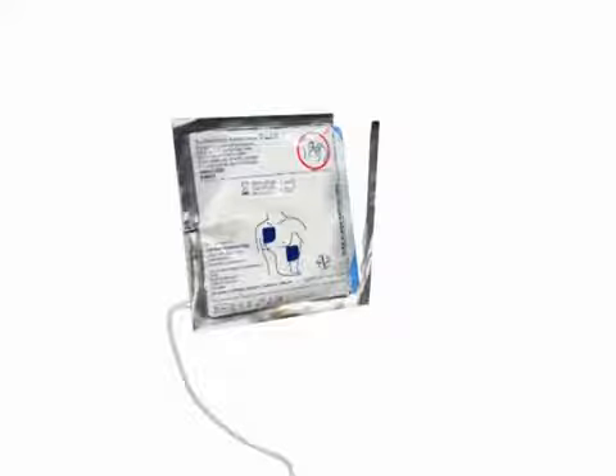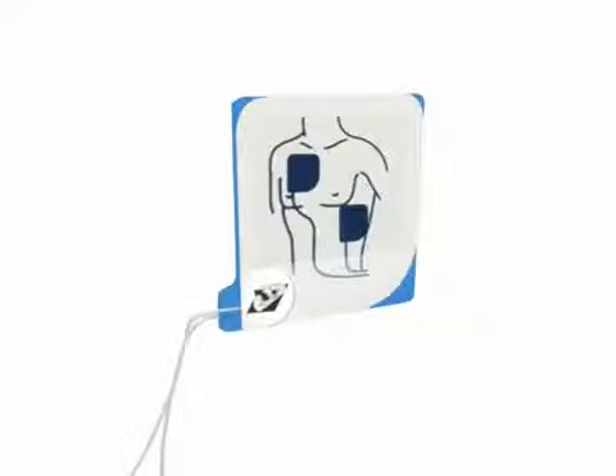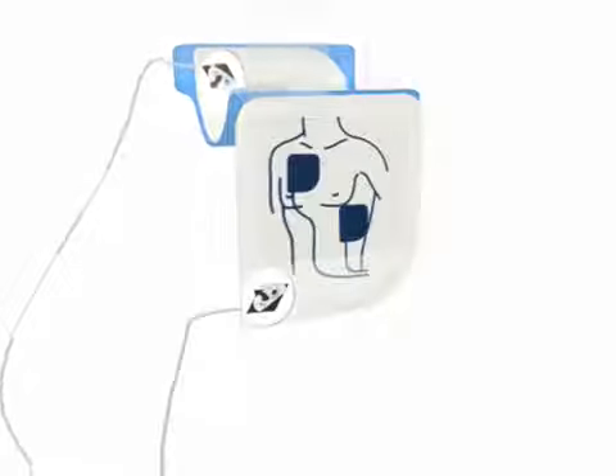Tear open foil package across dotted line and remove pads. Next, separate one of the white pads completely from the blue plastic liner. Begin peeling from the tabbed corner.